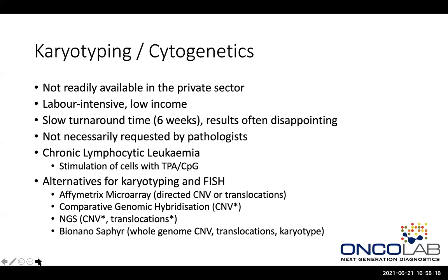I'll show you quickly. It can detect translocations. And then there's this thing I got very excited about, the BioNano Saphyr. I think 2 or 3 of these instruments have been placed in South Africa. I don't know where. The stocks went through the roof in the United States over this thing.